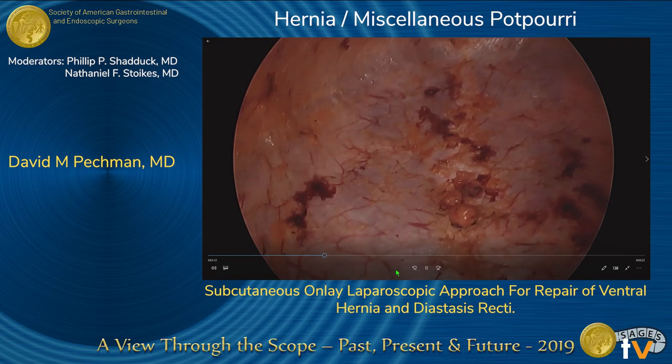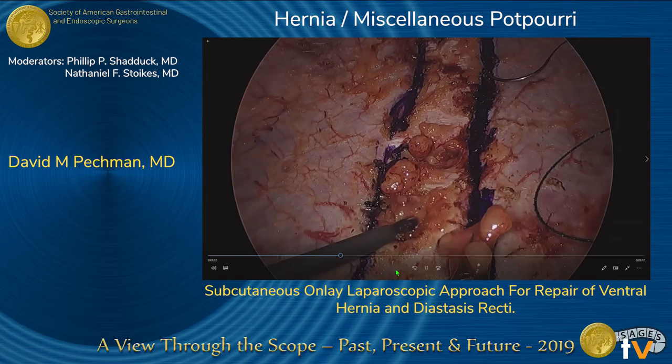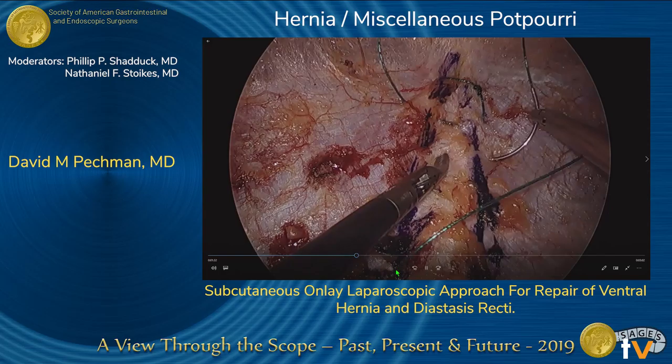The edges of the diastasis were marked using an ink tip which had been removed from the marking pen. The preperitoneal fat associated with each of the hernias was amputated and removed. The diastasis was placated using a 3-O V-lock suture from the xiphoid process to the pubic bone.